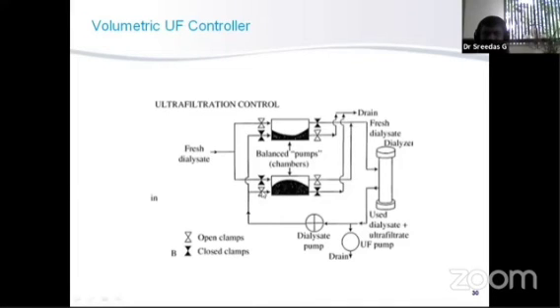So what happens when the used dialysate comes and fills up this chamber, the flexible membrane pushes the fresh dialysate to the dialyzer. So it is a continuous process of subjecting fresh dialysate as well as the used dialysate to the dialyzer as well as to the drain.